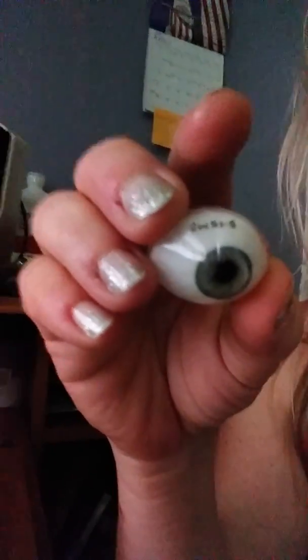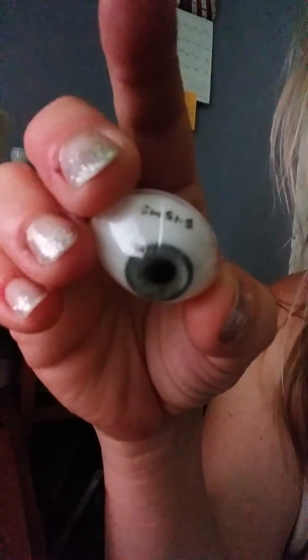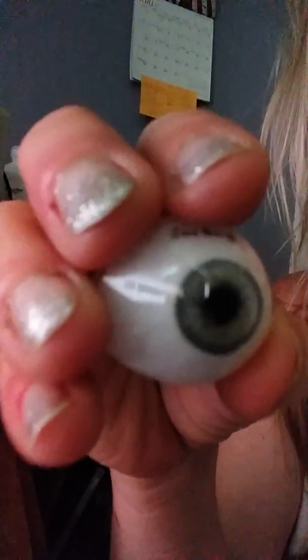Okay, now let's start off. Here is the eye. Up here will be the initials and the year that the eye was made. This is hand painted with a little paintbrush.